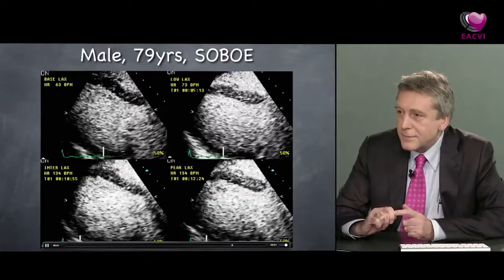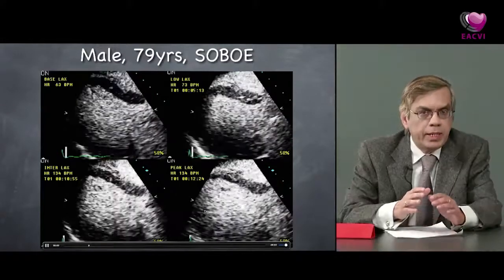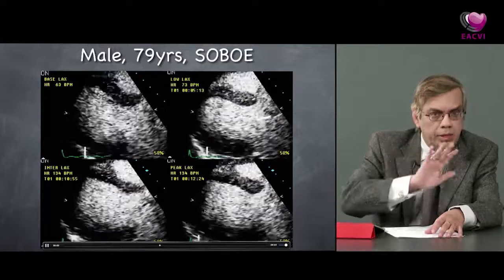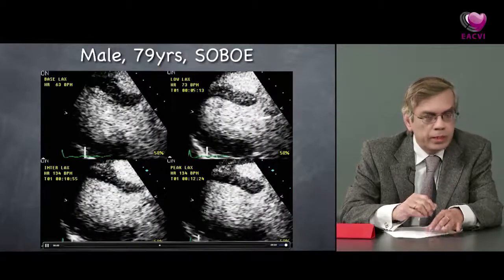So yeah, this case clearly illustrates the fact that the LV dilated after becoming smaller, which clearly suggests a huge amount of myocardial ischemia and is likely to be 3-vessel disease.